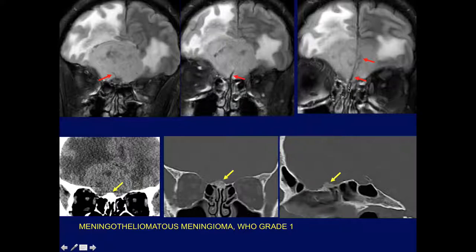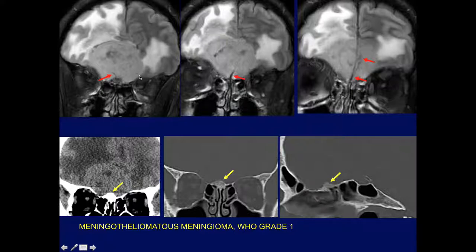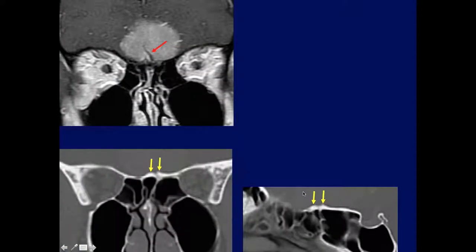Another case showing this vascularity — when you see that, you can be very confident you're dealing with a meningioma. This was a grade one benign meningioma. The amount of edema surrounding a lesion is no indication of the grade — this grade one meningioma had extensive edema. It does not tell you if this is a malignant or benign meningioma. And again, hyperostosis.